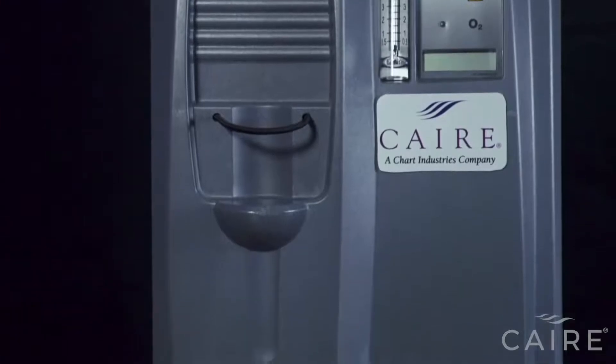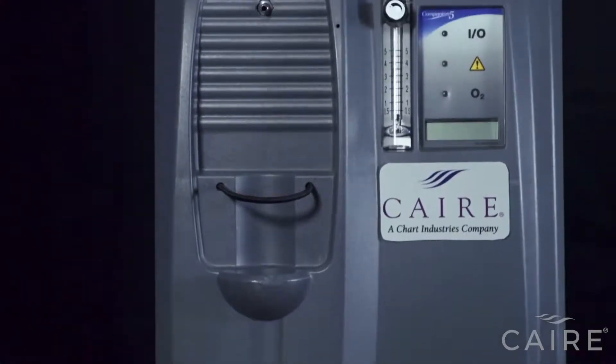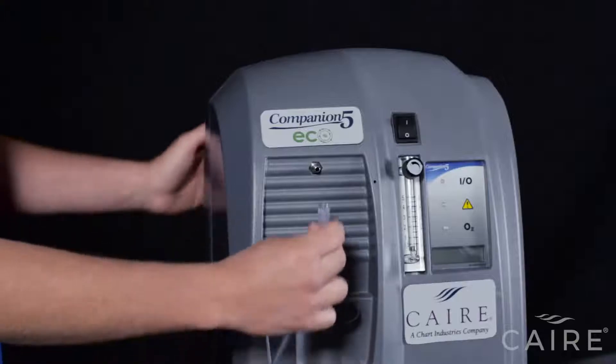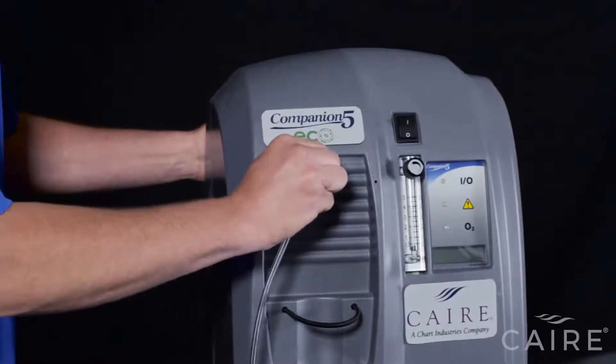The first step is connecting your cannula or oxygen tubing. The Companion 5 can take up to 50 feet of oxygen tubing. If you're not using a humidifier bottle, you simply attach your cannula or tubing to the robust metal cannula barb on the Companion 5, like so.